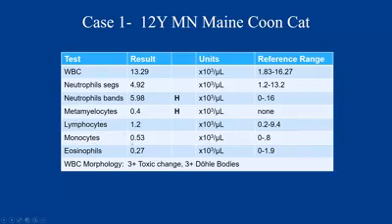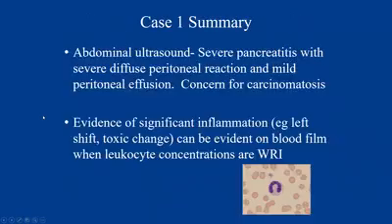Lesser numbers of lymphocytes and monocytes, and then we're seeing significant toxic change in this patient, again, something that our analyzer wouldn't have identified. Another important thing to note, right, is our white cell count is within reference interval, right? So we don't even have an increase in white cells, but we're still seeing this notable morphologic change. So if you had just gone by your analyzer count and not looked at a blood film, you could have missed all of this clinically relevant information.